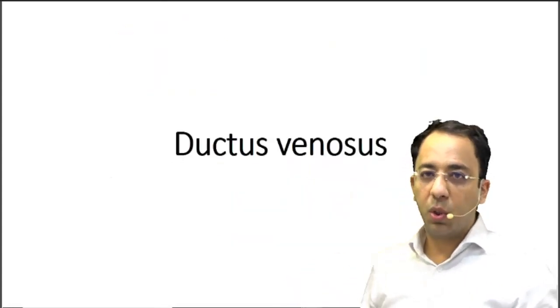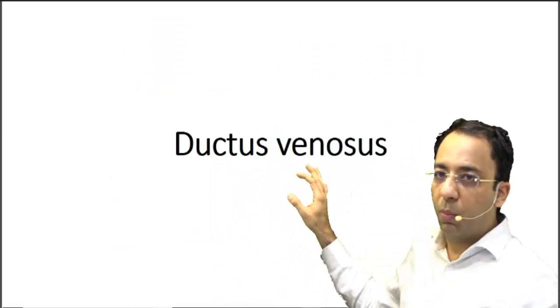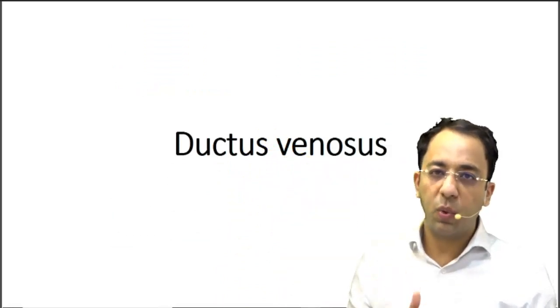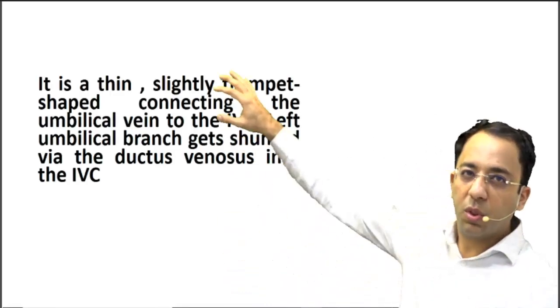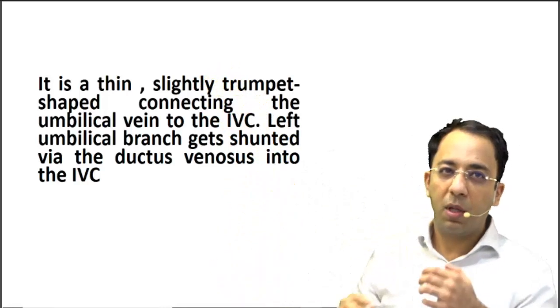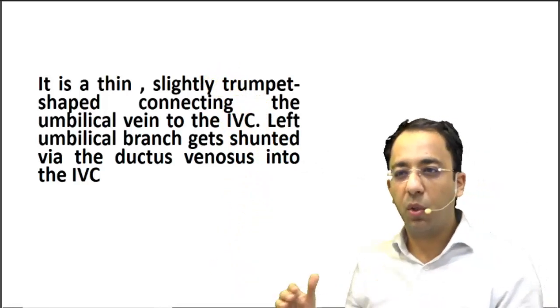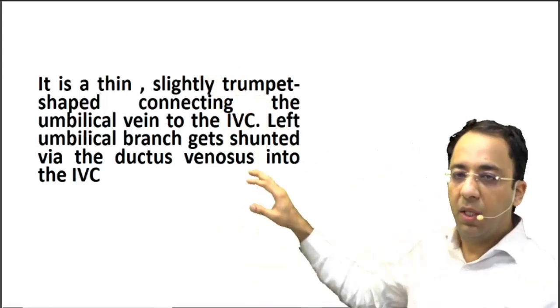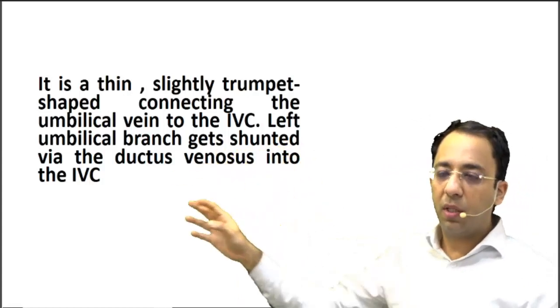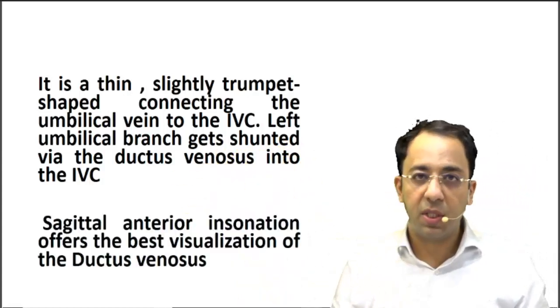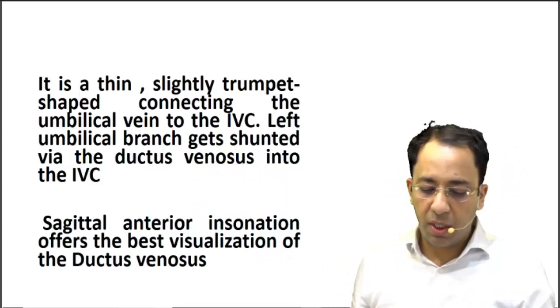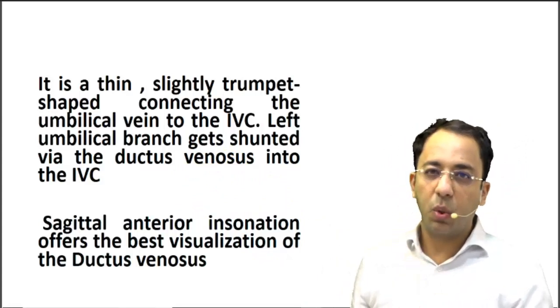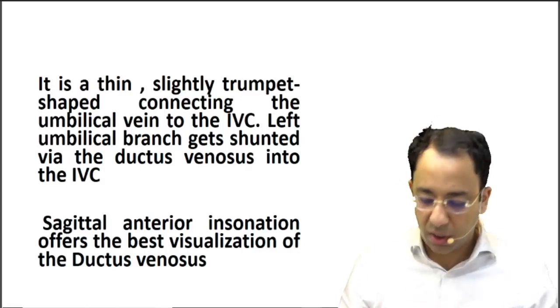Let me try to show you the vessel. What I'm going to talk about is the value of looking at ductus venosus during the Doppler study. Ductus venosus is this trumpet-shaped vessel connecting the umbilical vein to the inferior vena cava, and the blood from the left umbilical branch gets shunted via the ductus venosus into the IVC. While doing Doppler, the sagittal anterior insonation is going to give you the best visualization of ductus venosus.